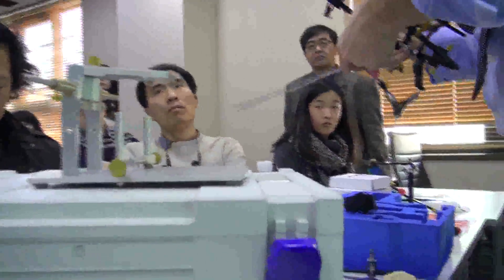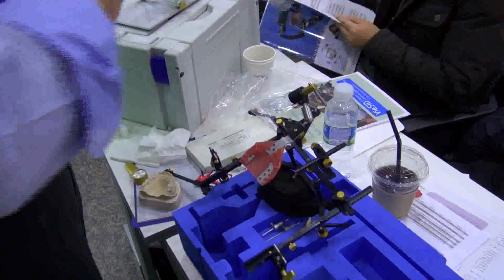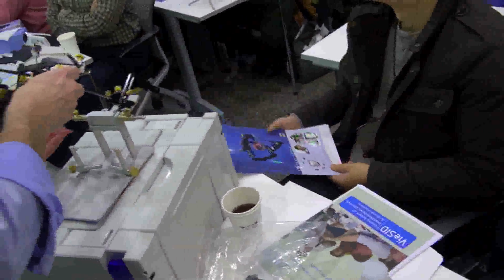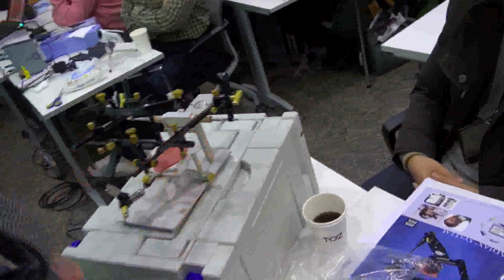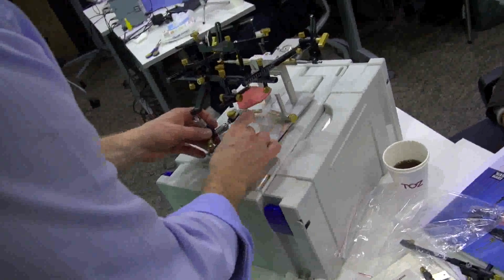And as Marcus said before, and you have seen the picture, we also transfer the hinge axis onto the patient's skin. We put a little metal piece onto the skin, and with these metal pieces, 1, 2, 3, we send the patient to the cephalometric machine, so that in the Ceph analysis we can also see the same plane, so that our analysis from the Ceph skeletal analysis also relates to all our coordinate system findings in the articulator. So this is very important.